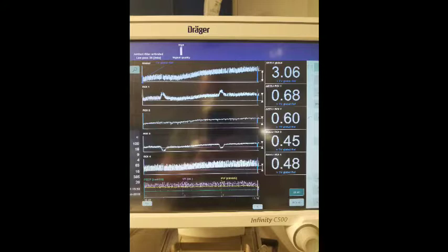You can no longer trust this trend, the total global impedance that's climbing up, and all those regions that are indicating to you that there's more ventilation, that we're recruiting. This is the tomography interpreting the changes in the fluid, because the electrodes are around the outside of the chest.